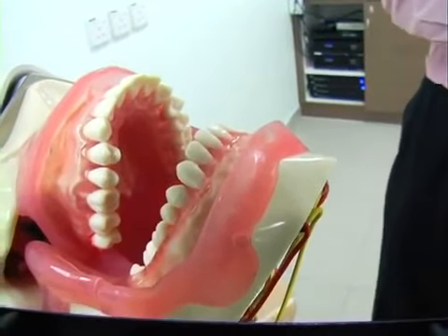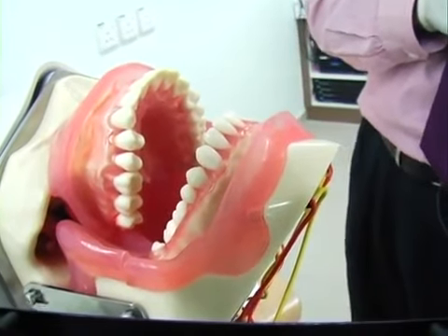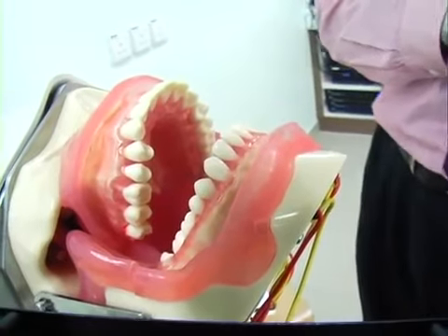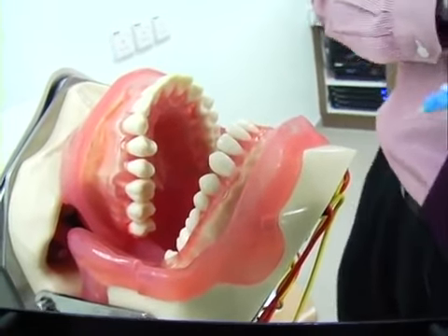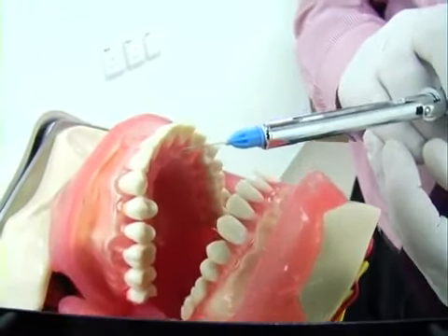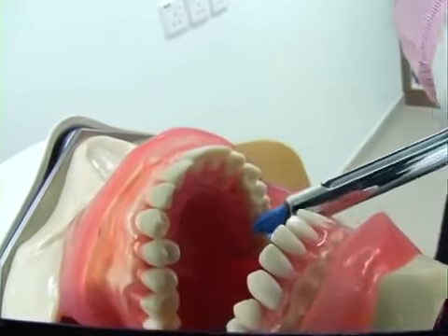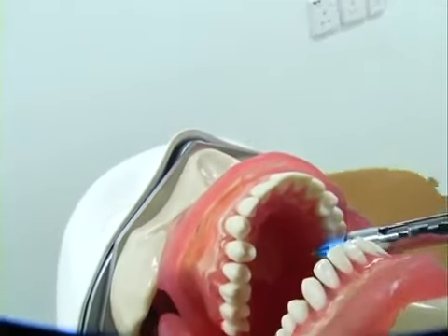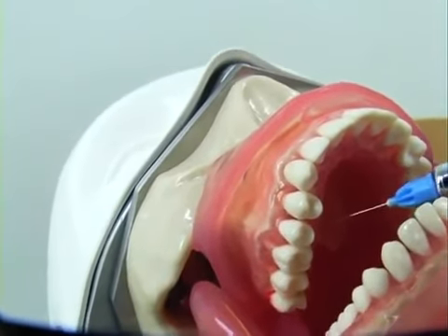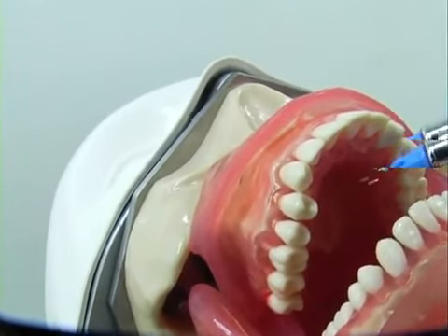Now we are going to demonstrate how to administer infiltration anesthesia around the maxilla of a mannequin. For infiltration on the palatal side, again you have to draw an imaginary line on the patient's mid-palatal area, and another imaginary line dividing the midline and the gingival crevice in the center here.